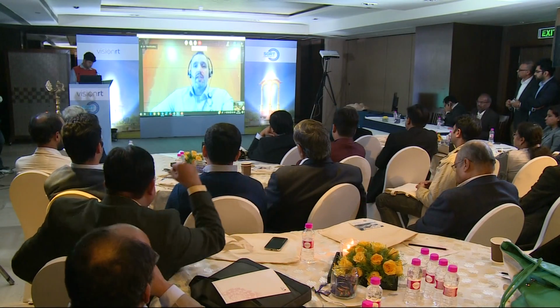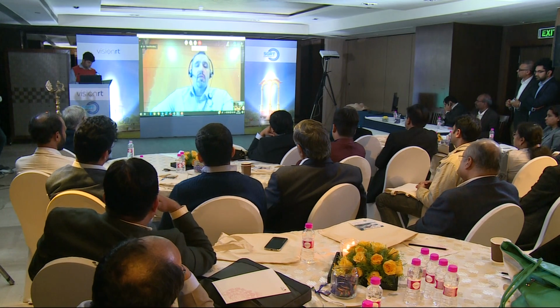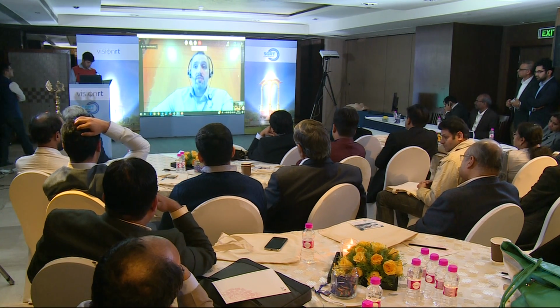It also allows you to immobilize in a more effective manner. You're not just rigidly clamping them down to a table, but you're trying to immobilize in an effective way, but also in a way that maximizes their comfort as well. And you don't have to worry that by maximizing their comfort, you're suboptimally immobilizing them, because now you're watching them with SGRT. So again, I think having an SGRT system or an immobilization system that complements SGRT is very important.